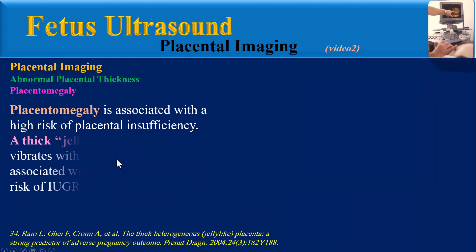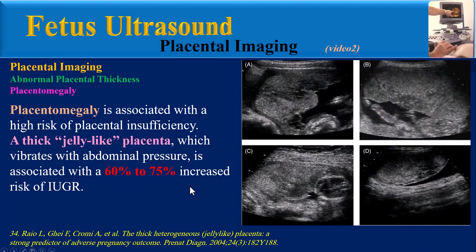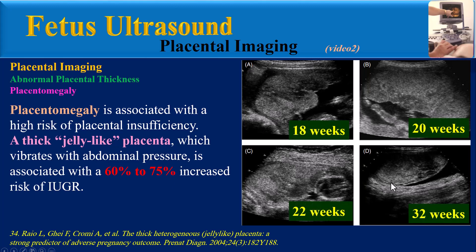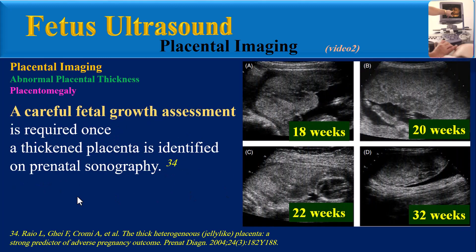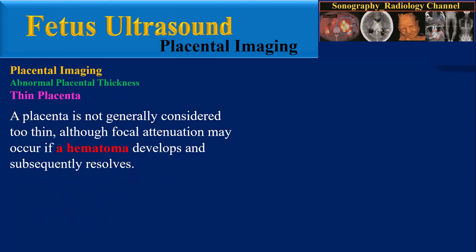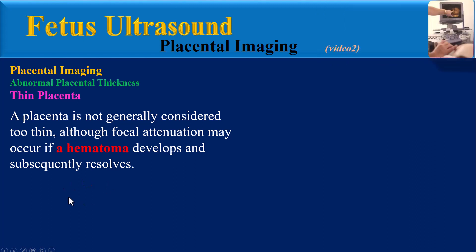Placentomegaly is associated with a high risk of placental insufficiency. A thick jelly-like placenta which vibrates with abdominal pressure is associated with a 60 to 75 percent increased risk of IUGR. This ultrasound image shows a thick heterogeneous jelly-like appearance of the placenta at different gestational ages: 18, 20, 22, and 32 weeks gestation. A careful fetal growth assessment is required once a thickened placenta is identified on prenatal sonography.